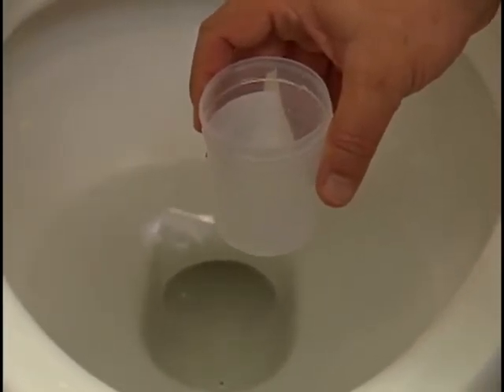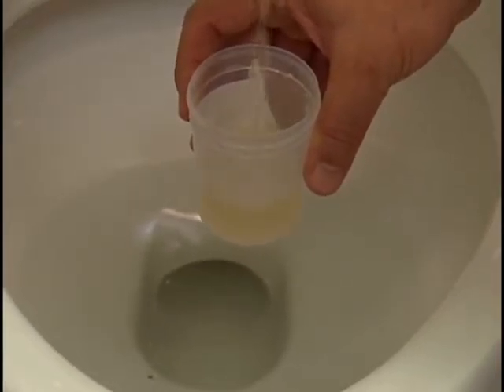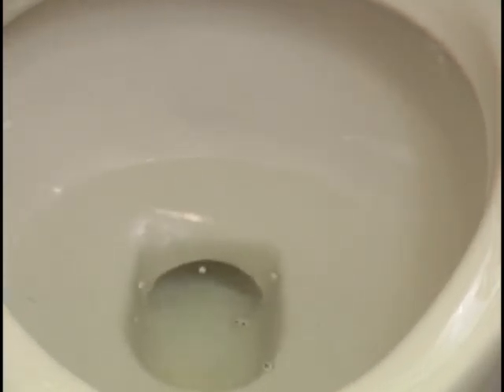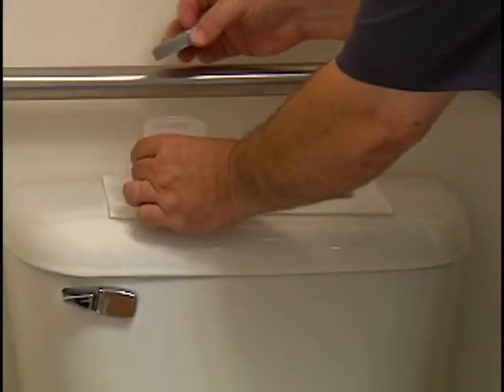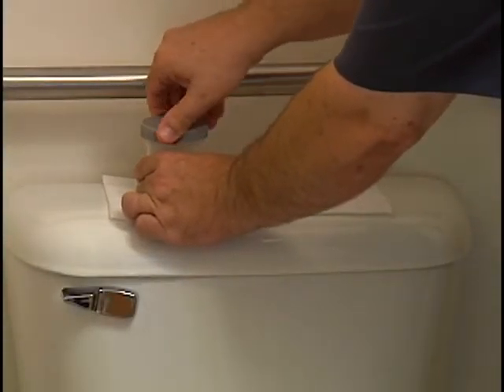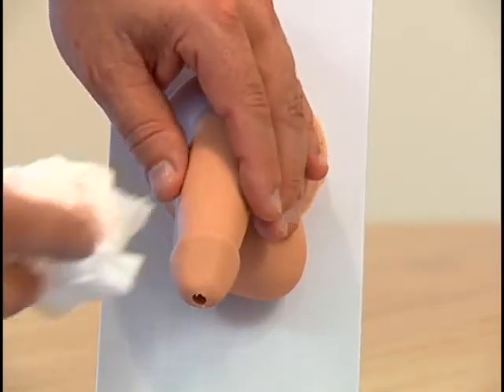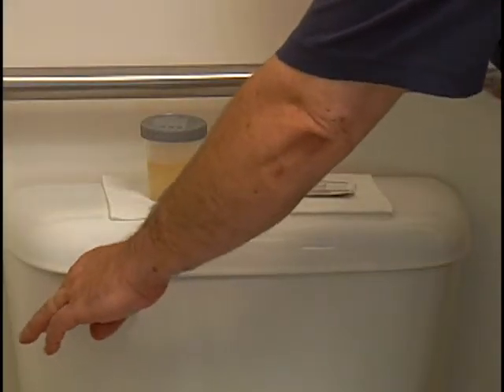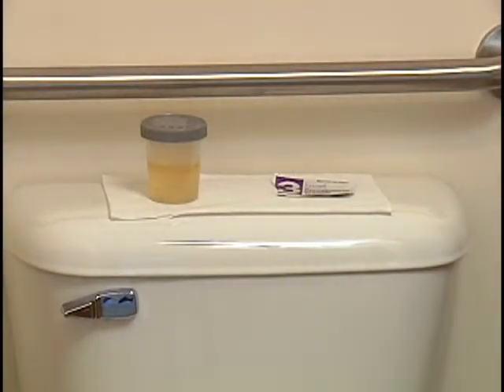Void a small amount of urine into the toilet. Collect the next amount of urine by voiding into the sterile container without touching the inside of the container. Fill the specimen container about half full with urine. Void the last amount of urine into the toilet and replace the lid on the specimen container. Wipe the area dry with a tissue and discard it in the toilet. Flush the toilet and wash your hands.